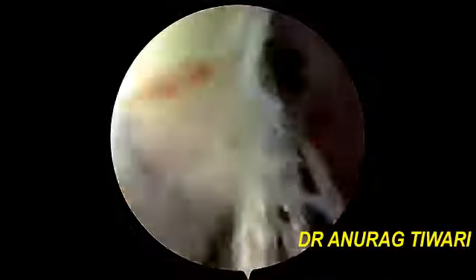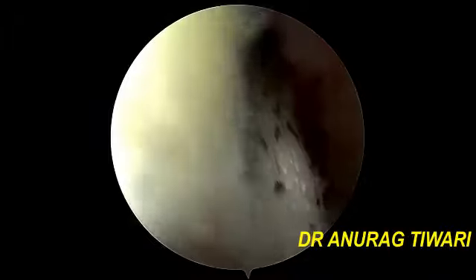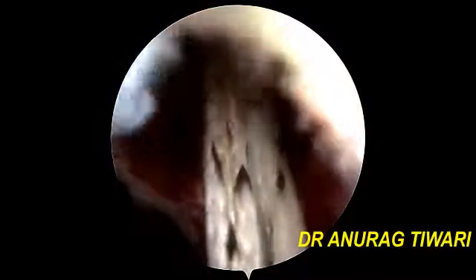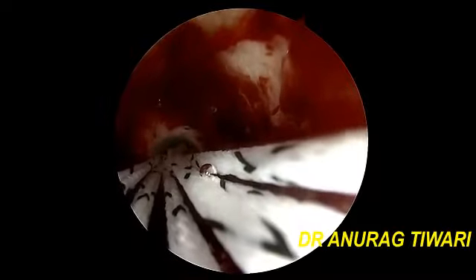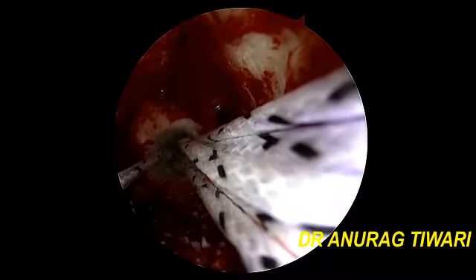You can see the beautiful femoral tunnel, and we are pulling these threads through the outer femoral cortex, and you can see the endo button. This shiny titanium endo button is just going inside the tunnel. We will move inside the tunnel. Now you can see the endo button. So this is just going at the edge of the cortex, and at this point now you can flip the button.